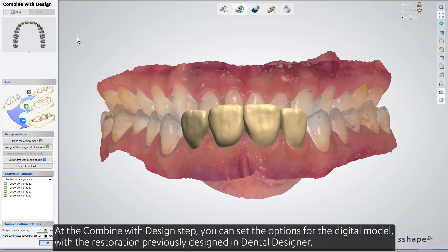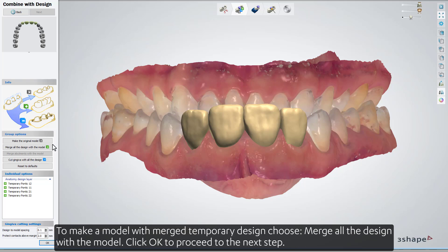At the Combine with Design step, you can set the options for the digital model with the restoration previously designed in Dental Designer. To make a model with merged temporary design, choose Merge All the Design with the Model.